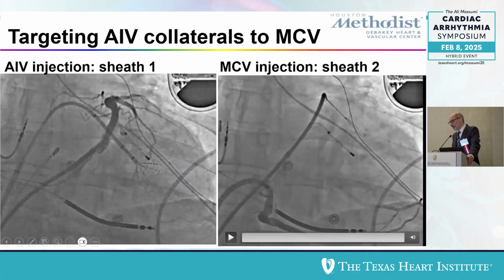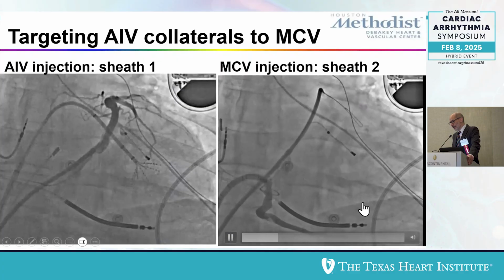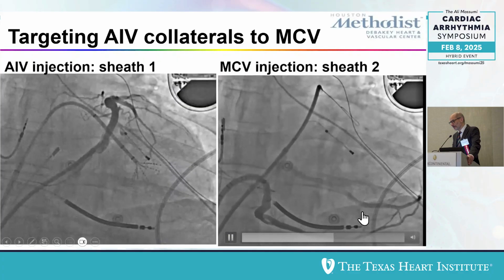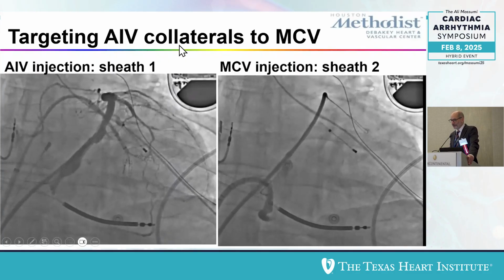Let me play this again. A collateral here that goes to the AIV. Be patient, you will see, there it is, very faintly. It goes up to the AIV. So I will show it again.